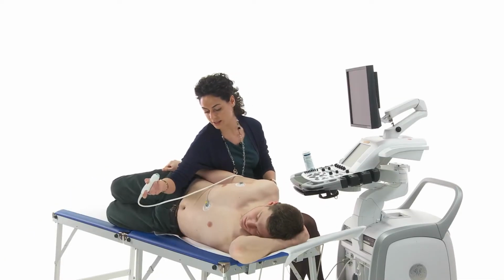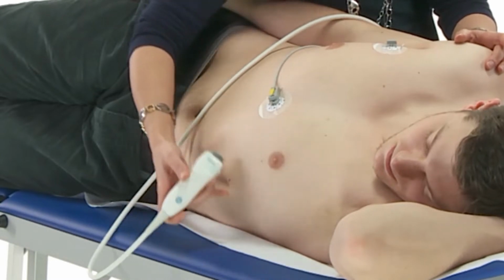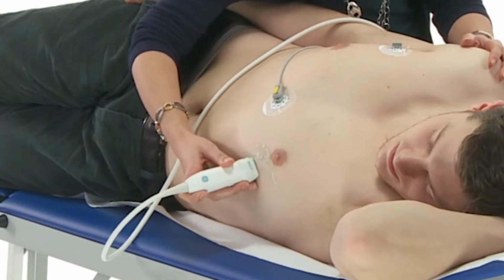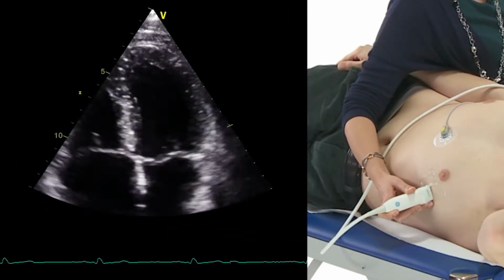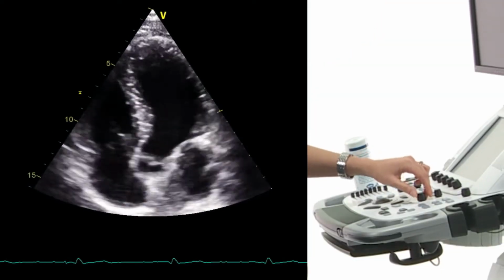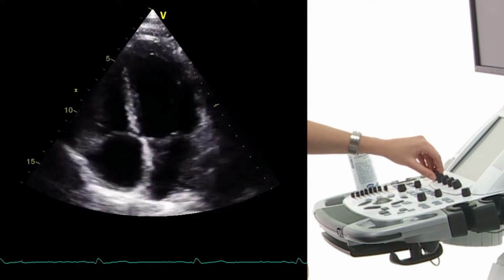I ask my patient first to lie on his left side, but not too much. Remember, we want to have this area really free to move our transducer completely. And then around the 4th, 5th intercostal space, I put my transducer. Remember, the marker now is pointing lateral. So playing a little bit, again, I focus only on my machine. I optimize my image, as you learned already. And I get my 4-chamber view. I make sure I can see all the structures in there.